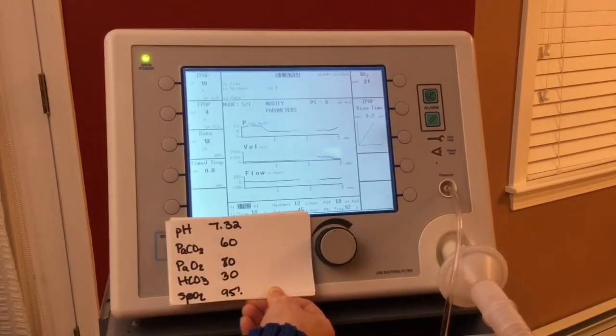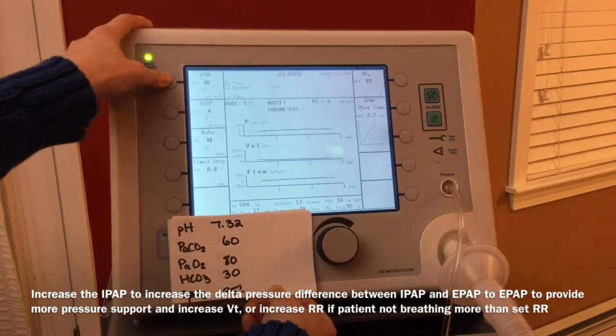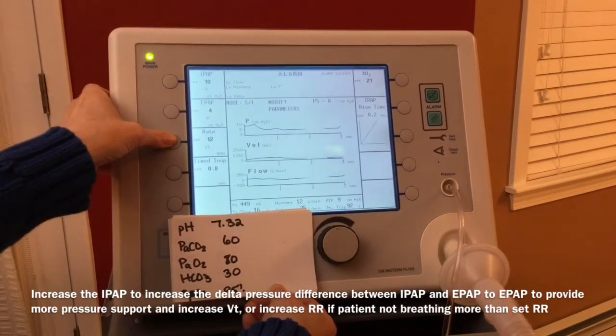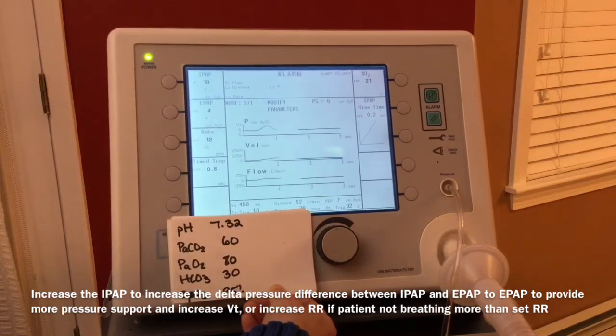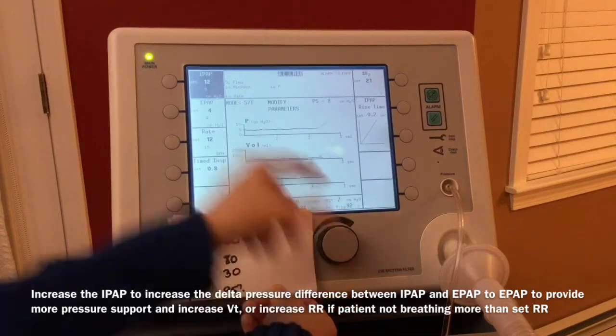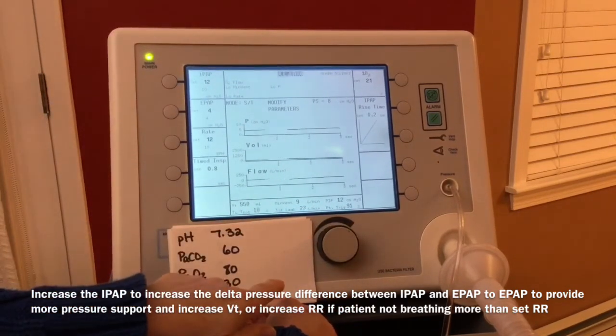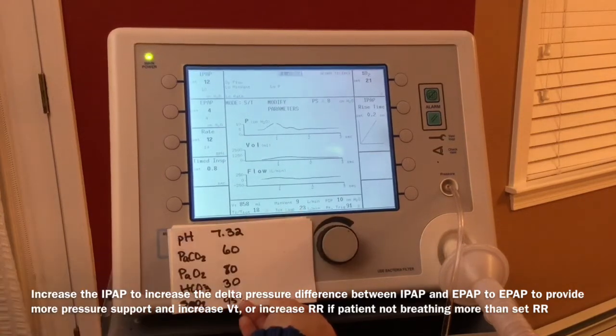What parameters would you change to affect ventilation when in non-invasive bilevel ventilation? Pause the video. If you chose IPAP or respiratory rate, you were correct. You can increase the IPAP by 2 or 3. Evaluate the new tidal volume and minute ventilation for the desired target minute ventilation.